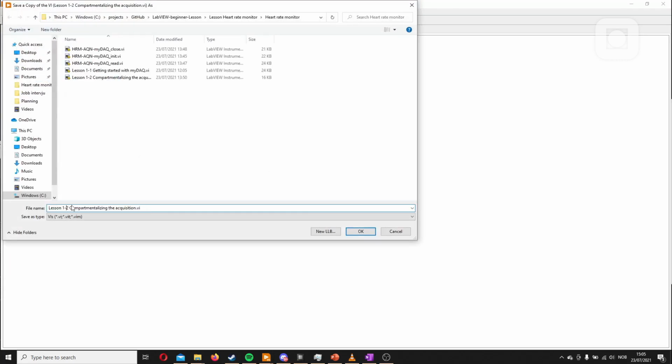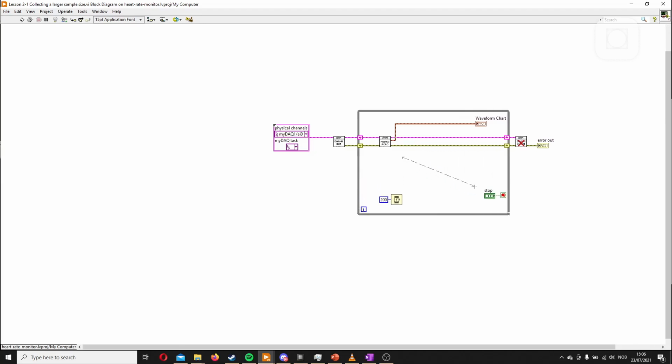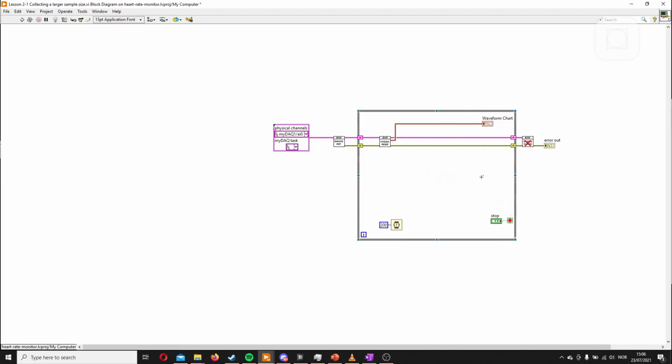So this is the lesson, we can delete all of this. It's 2-1, and it's called collecting a larger sample size. What we need to do is to make a VI which gathers the read data and collects it to a larger sample size, a sample size set by us. We'll just make this larger as we will make the functionality here.